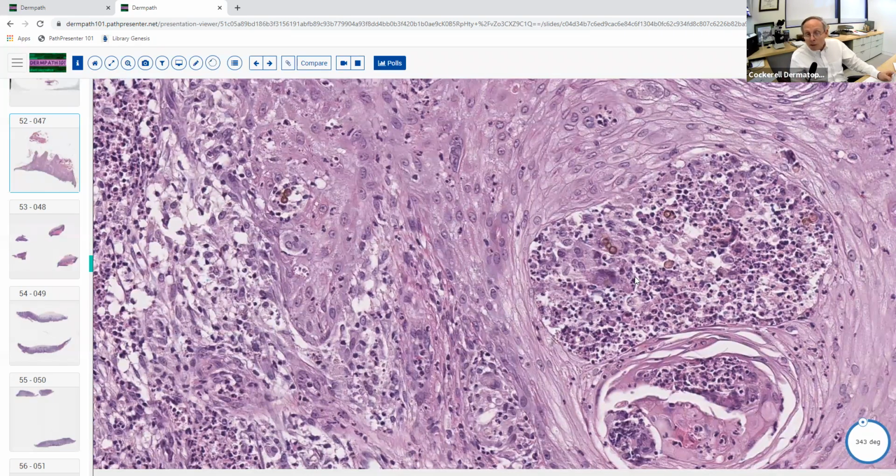And then sporotrichosis. Well, obviously this is not a sporo. So shame on anybody that would choose sporotrichosis here. You get the infectious part right, but you don't identify the organism. So again, they might ask you some questions about some of the causative organisms, Cladosporium, Pseudallescheria boydii, some of those organisms. Make sure you know a little bit about those. They're not asking a lot about dematiaceous fungi these days, but if they do ask a question and you know what causes this, you're just going to get a free question. So go ahead and at least know a little bit about that, and you'll be better off than perhaps somebody sitting next to you.